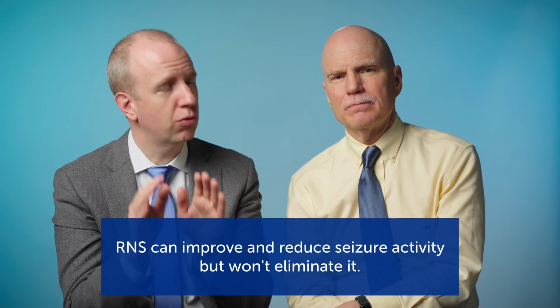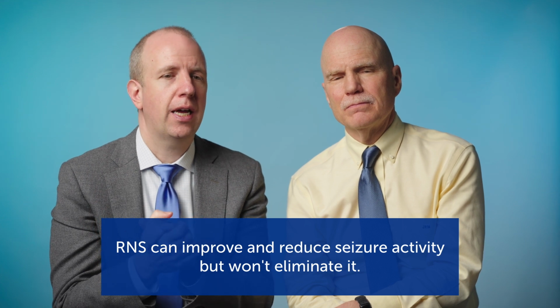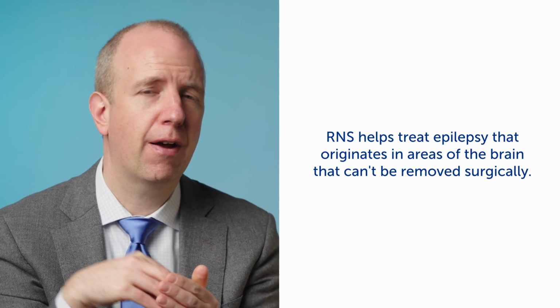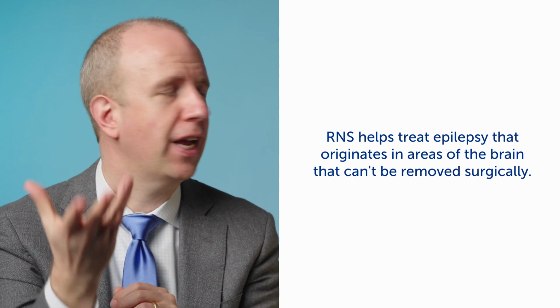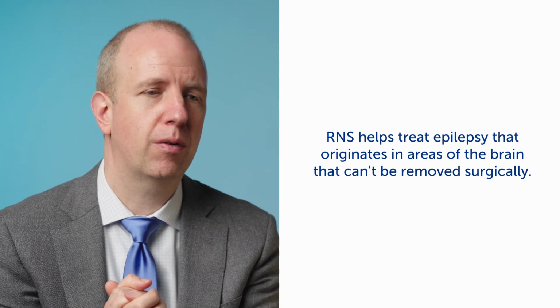RNS is usually a therapy that can improve seizures meaningfully, but may not eliminate them completely. And typically, it's seizures that are arising from one or more specific focuses in the brain, or foci, that maybe are not ones we can remove safely. Maybe they're involved in moving your hand or involved in your eyesight or things like this that we want to protect.